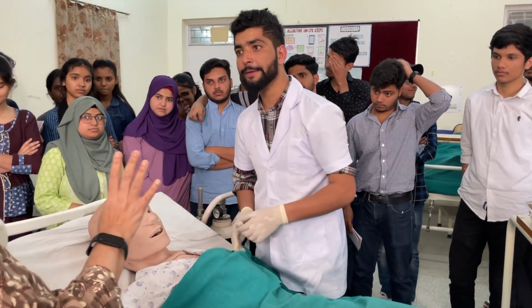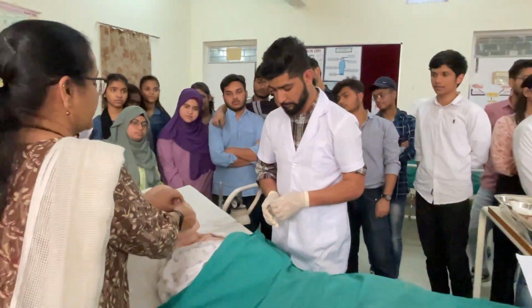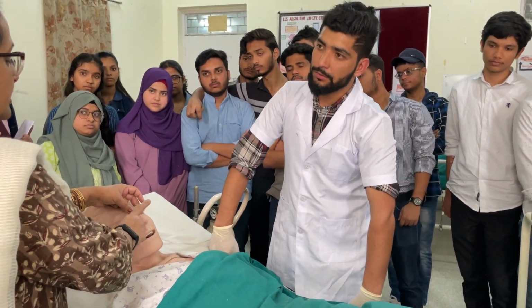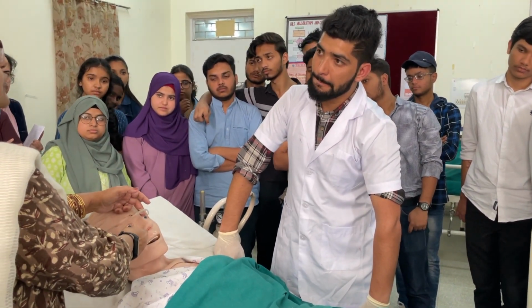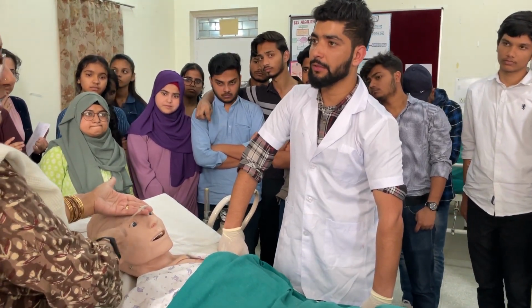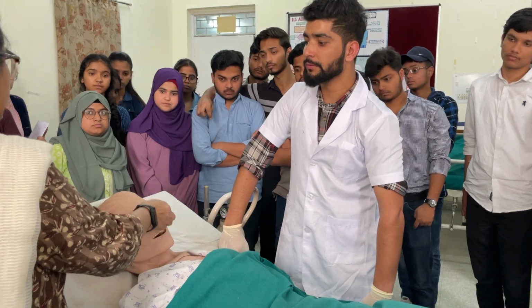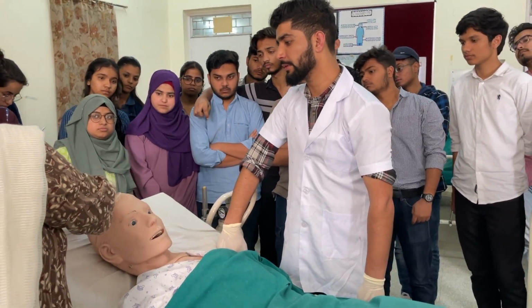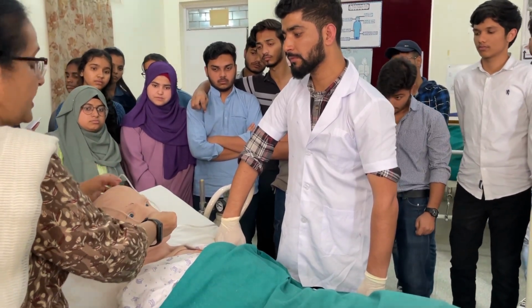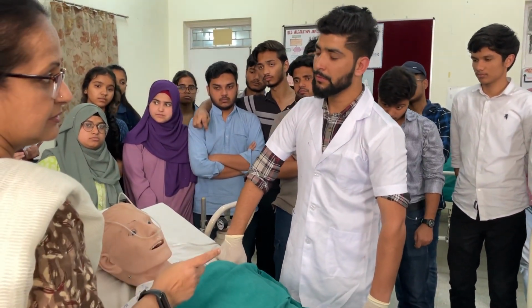One thing, if you are going to put the prongs, before putting them into the nostril you have to check whether the oxygen is coming or not. Not after putting it into the nostril. After putting it, don't try opening the regulator.